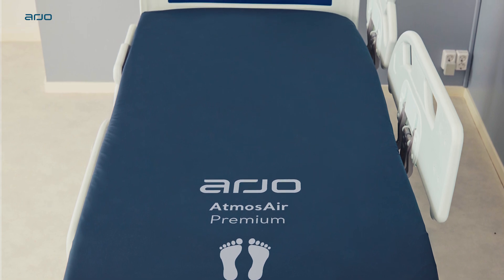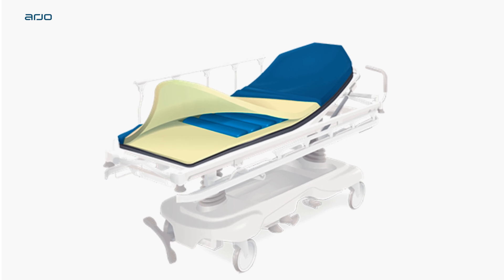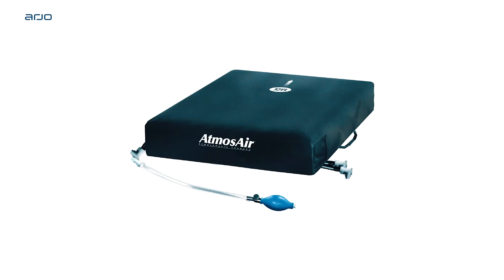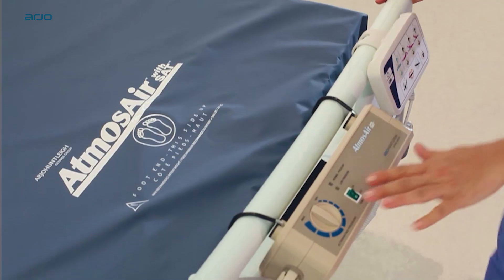The Atmos Air 9000 range includes a standard MRS, stretcher MRS, bariatric MRS, and seat cushion. It also includes a powered version: Atmos Air 9000 Active.